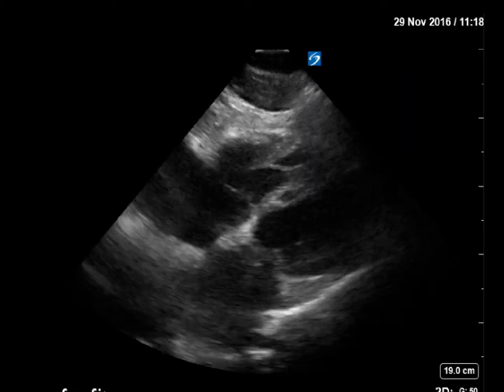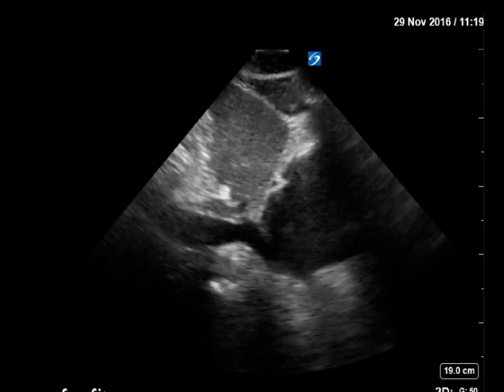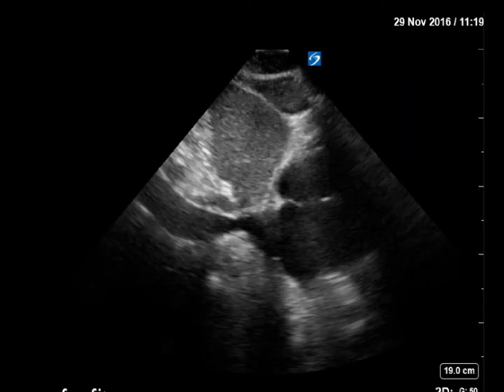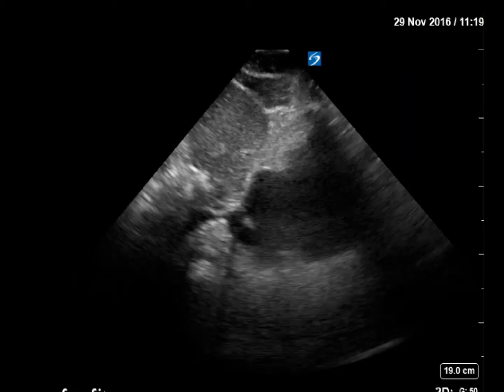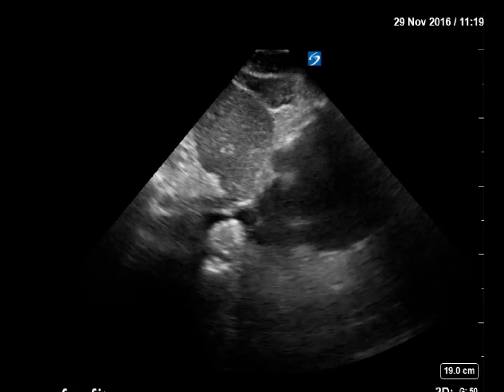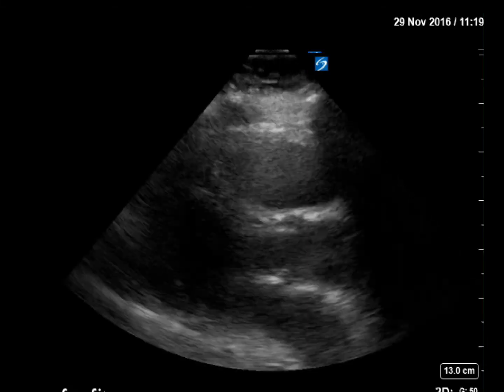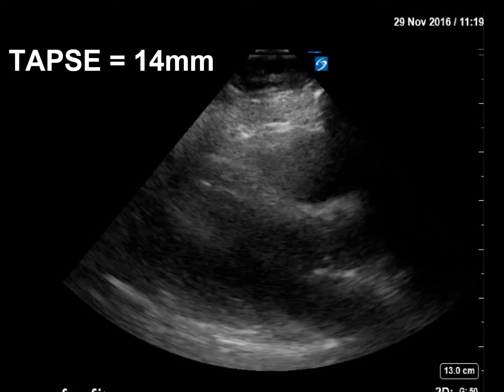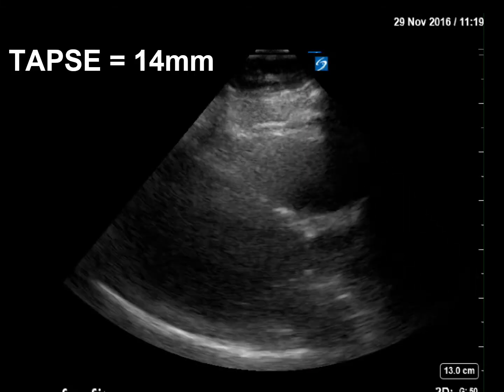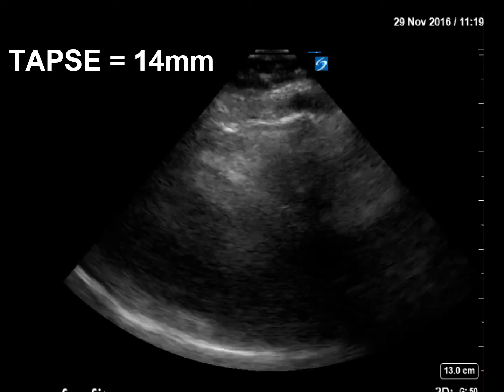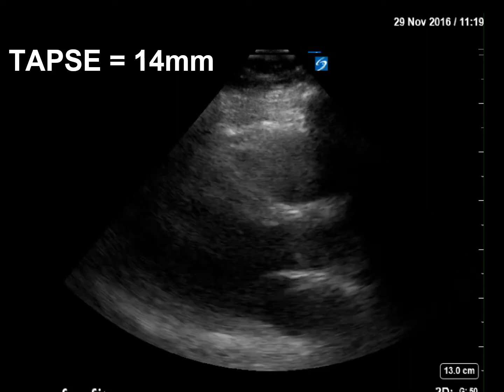Patient one is mildly tachycardic and hemodynamically stable. Labs and EKG are pending. You measure a TAPSE of 14 millimeters. Your treatment options include heparin, intervention, or TPA.